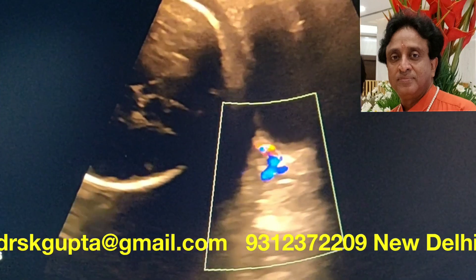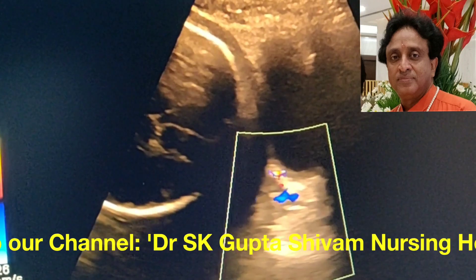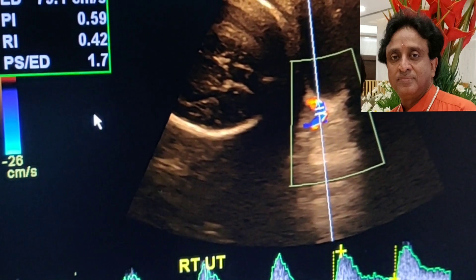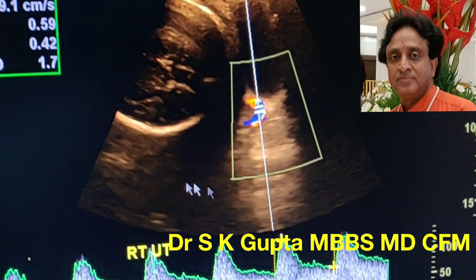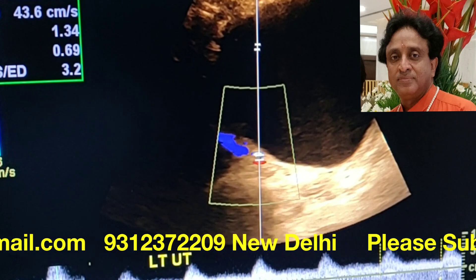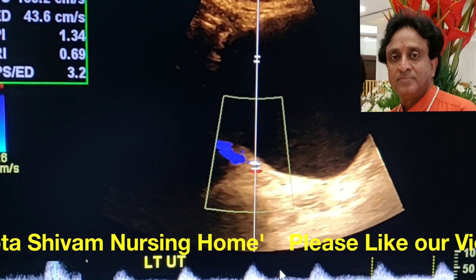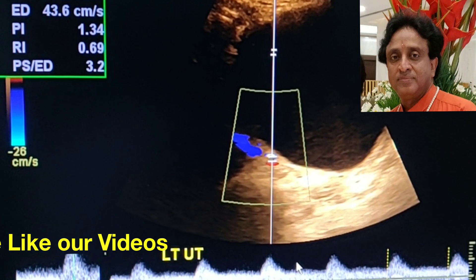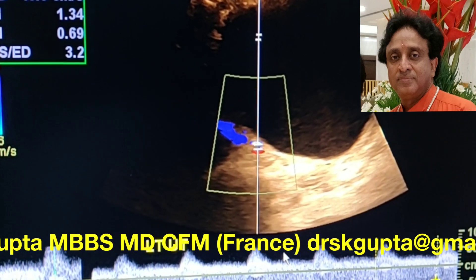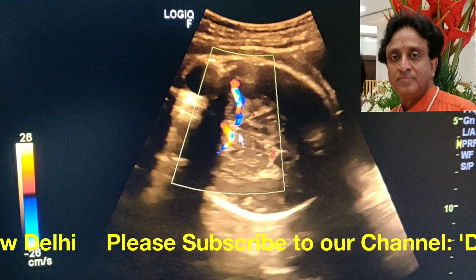We will now perform a color Doppler scan for uterine flow, placental flow, and cerebral flow. This is the uterine artery on one side — the uterine flow is nearly normal in the right uterine artery with a resistance index of 0.42, which is normal. On the left hand side the resistance index is 0.7. There can be a difference between both uterine arteries because the placenta is on the right side, so overall uterine flow to the fetus is considered normal.